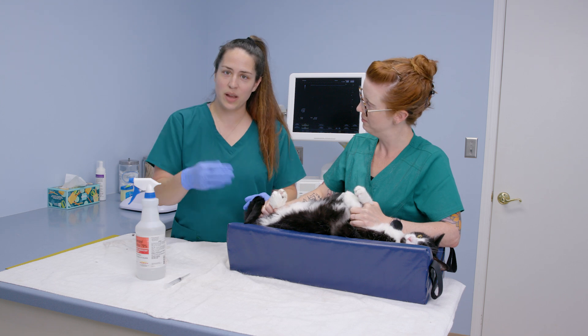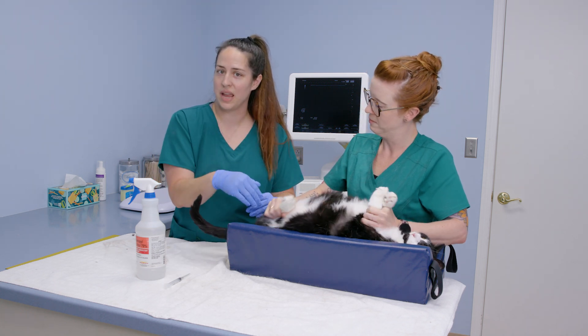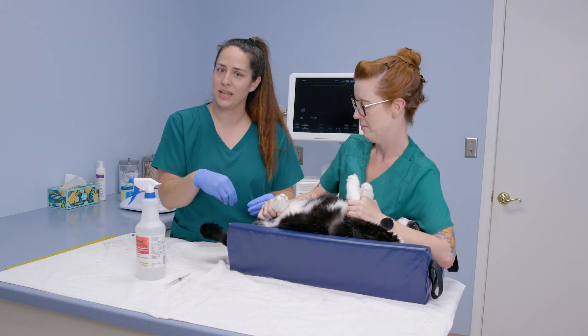We'll go ahead and switch sides so I can visualize what's happening on the screen with the ultrasound, as well as being able to see where probe placement is and being able to place the needle.